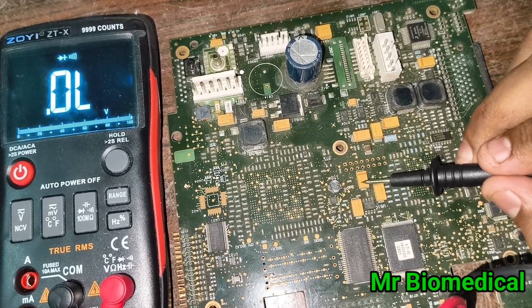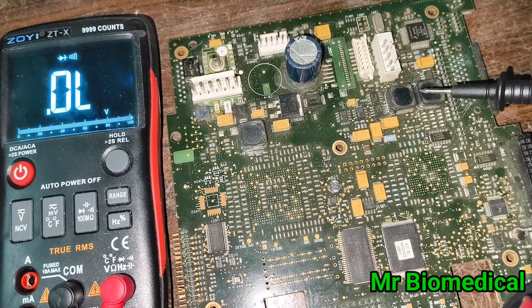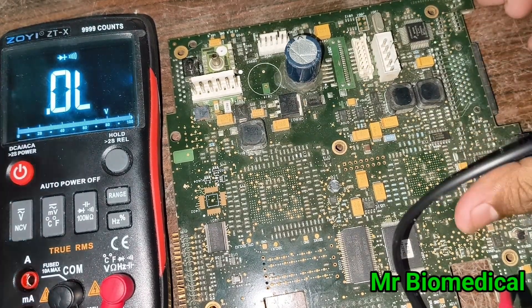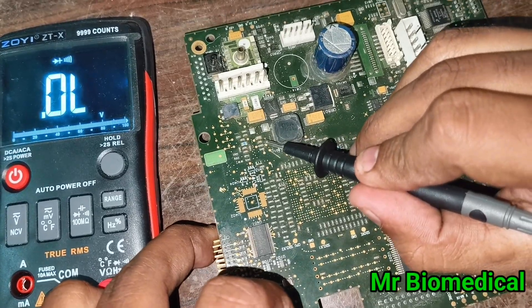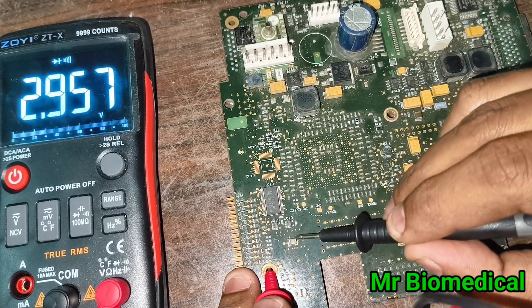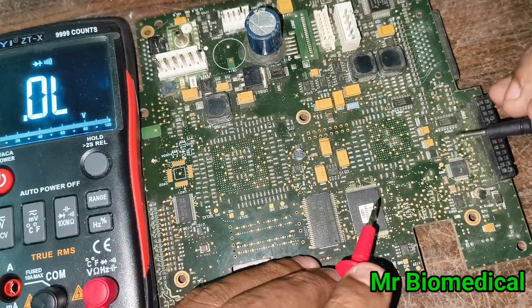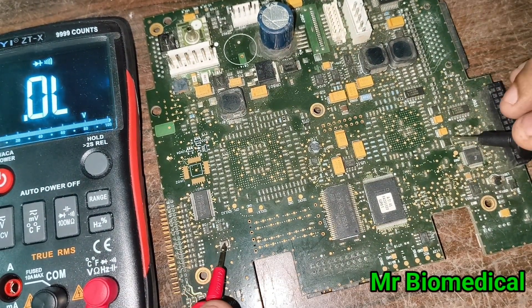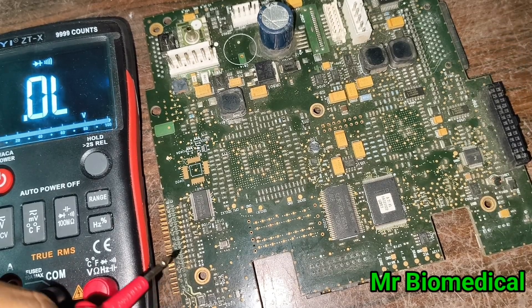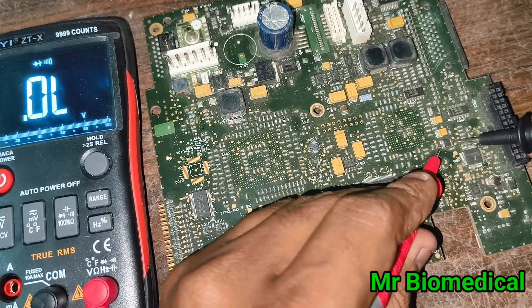Let's get started with the capacitor. This is a tantalum capacitor — as I told in the previous video, this is how tantalum capacitors look. These are normal capacitors, marked as 'C'. Sometimes you may have confusion between a fuse and a capacitor because they look similar, but you have to identify the difference. This here is a fuse.